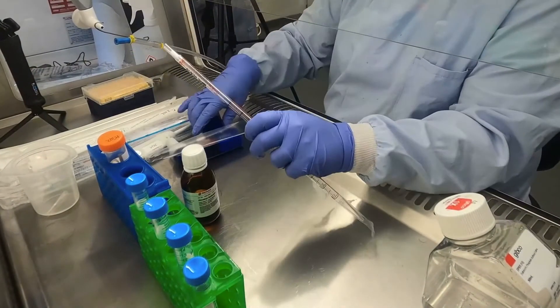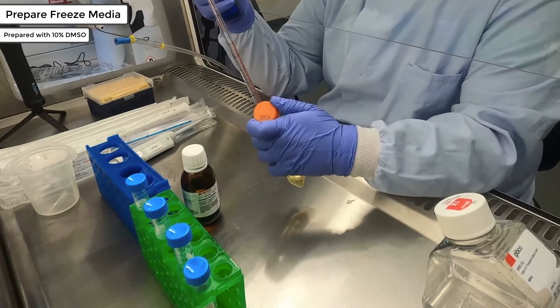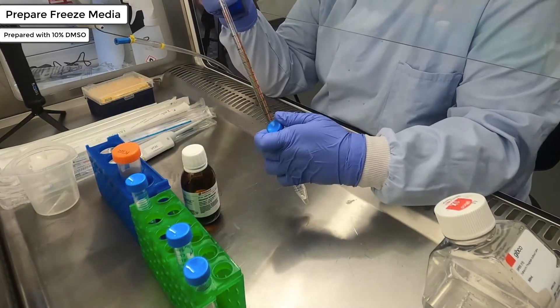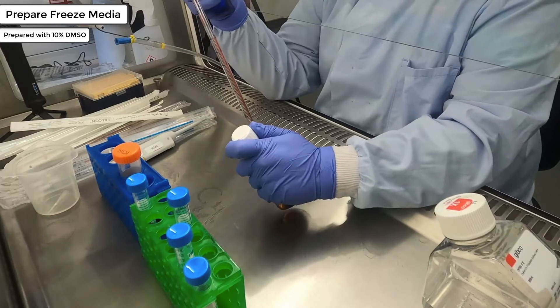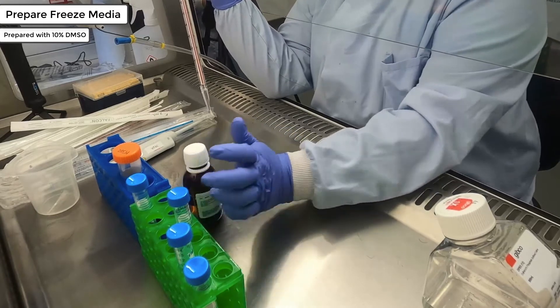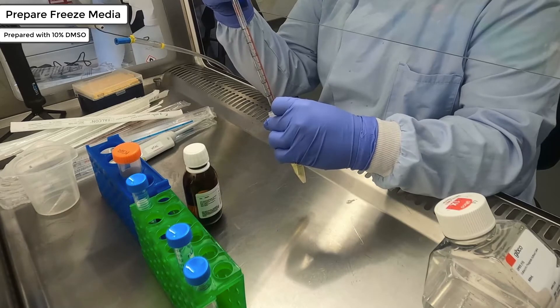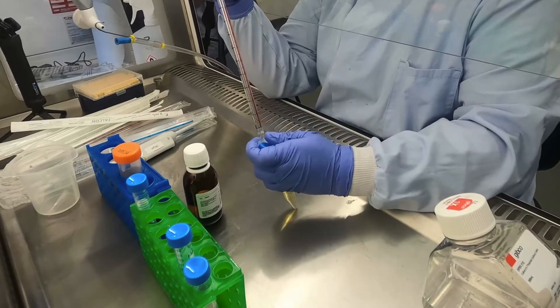The first thing you need to do is prepare your freezing medium, which is 90% KSR plus 10% DMSO. This should be scaled according to how many wells you are banking. In this demonstration, Leighton is combining 9ml of KSR with 1ml of DMSO. After mixing, the freezing medium should be stored at 4 degrees until you're ready to use it.